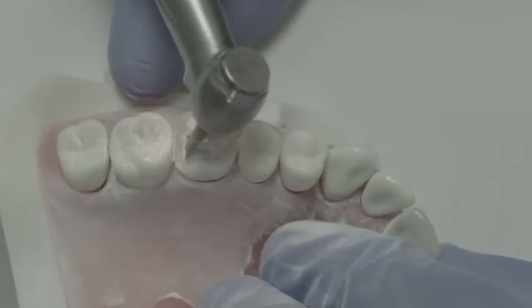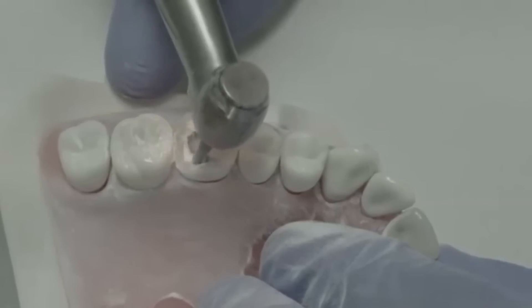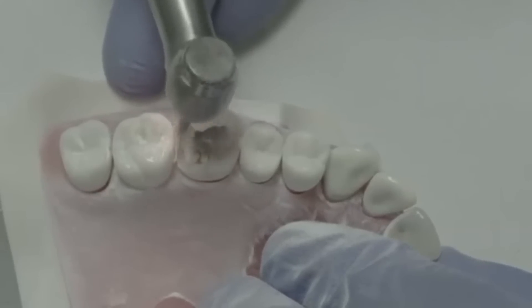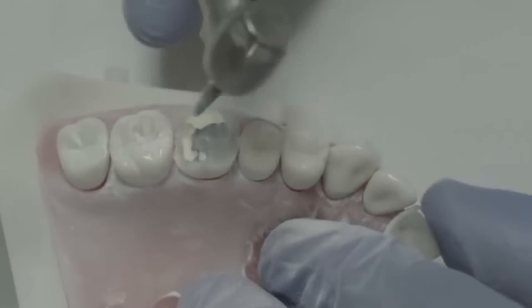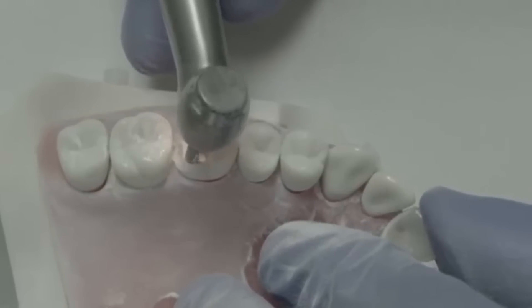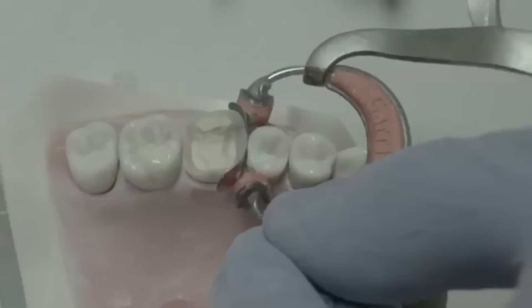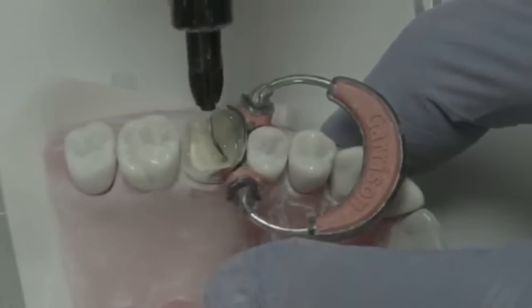On the video you see now, we're doing it on a typodont — you can see, somewhat exaggeratedly, the kind of tooth we use in our workshops at the LA Institute. After occlusal reduction, because we already know we're going to do an onlay on this case, you can see how much caries is present. We continue to remove the caries, leaving the enamel that is healthy. We remove the caries on the dentin while preserving the enamel, and as you can see, the caries on the dentin continues to go quite deep. Once we remove the caries on the dentin, we repair the enamel with bonded composite — as you see right here — using a matrix band. After repairing that enamel, our margins will be supergingival and the cementation will be very simple.